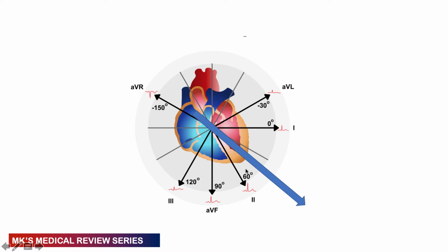The QRS complex will be predominantly positive because this impulse is flowing towards this direction, and it's obviously going to be giving you this positive deflection on the QRS complex, such that if the impulse shifts away from these axes into a different quadrant over there, it's going to cause different changes on our ECG.